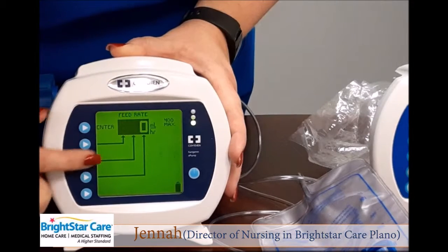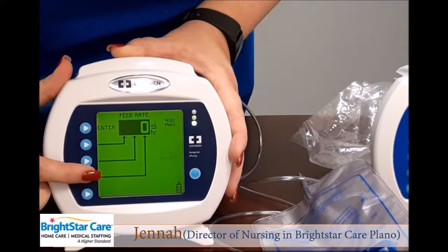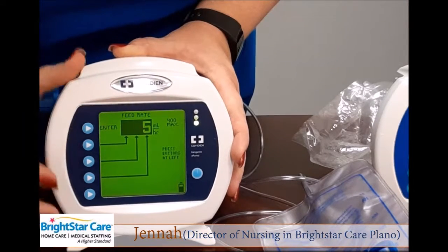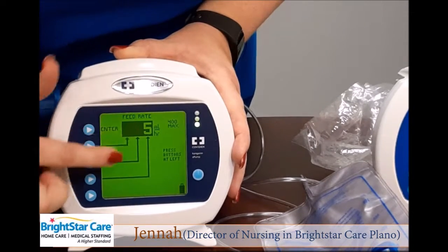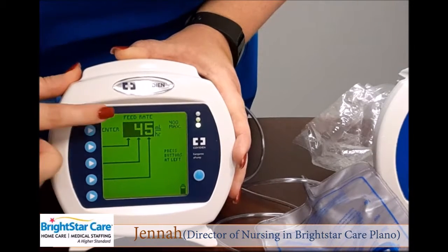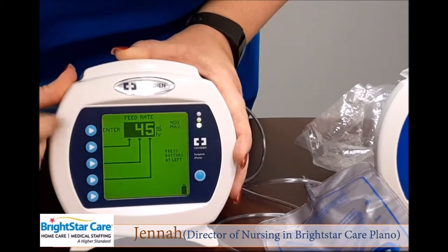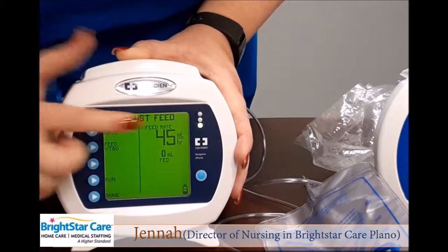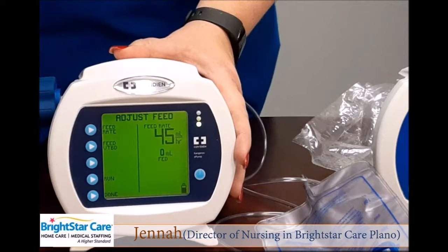I'm going to select the line for my ones place, and I'm going to press that arrow 5 times until I get a 5 in my ones place. I'm going to now move to my tens place and press 4 times. That gives me a rate of 45 cc's an hour. I'm finished setting my rate, so I'll hit enter. You notice on my screen my rate has been set at 45 cc's an hour.